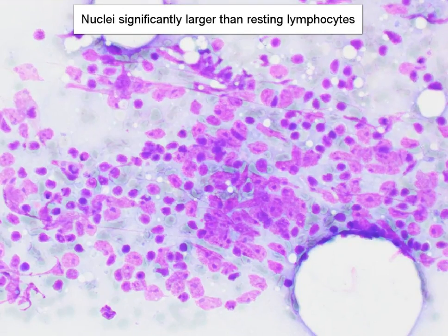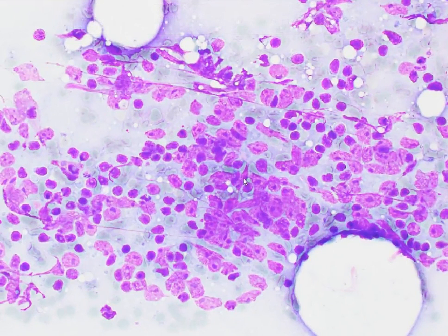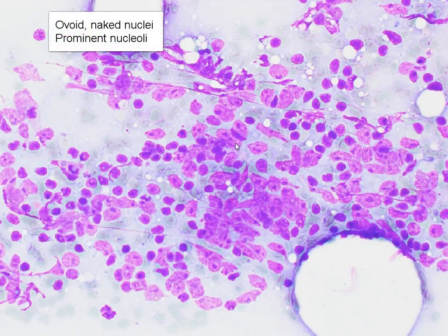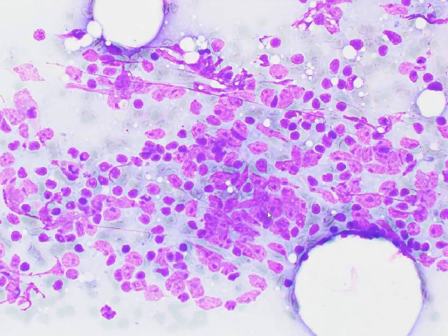Moving around, for example in this area, many of the nuclei appear naked. They are quite ovoid and irregular, and we can appreciate very prominent nucleoli. There are not that many lymphoglandular bodies in the background, but these malignant cells are closely associated with lymphocytes.